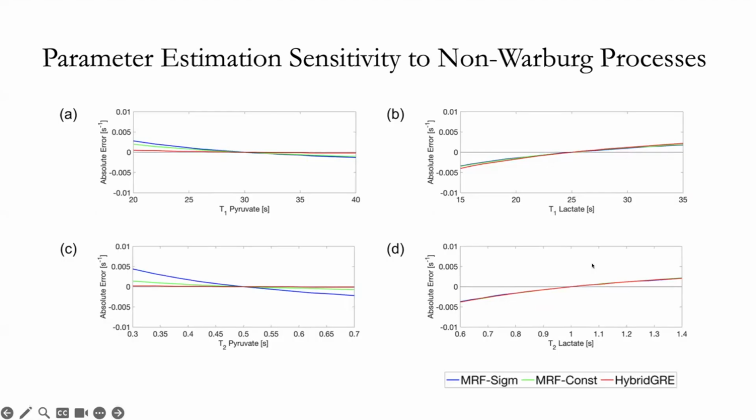And the precision of matching, as I mentioned before, is not the only factor. Now that we're going into a much more involved pulse sequence method, we do now have to worry about how our other sequence or tissue parameters potentially influence the parameter estimation of KPL.